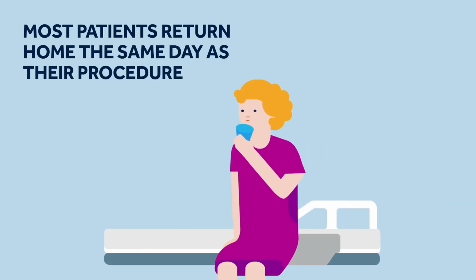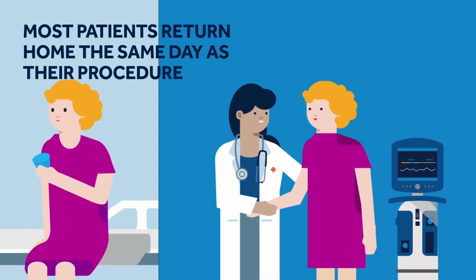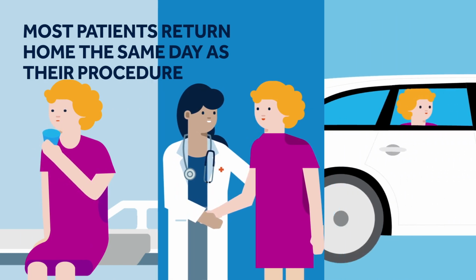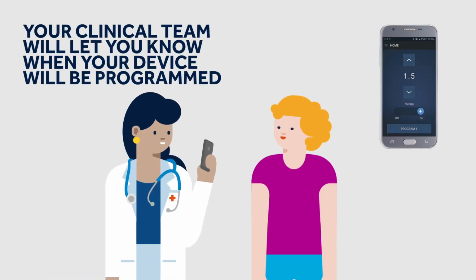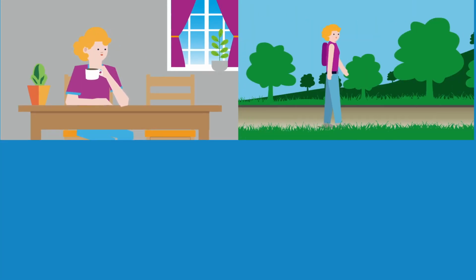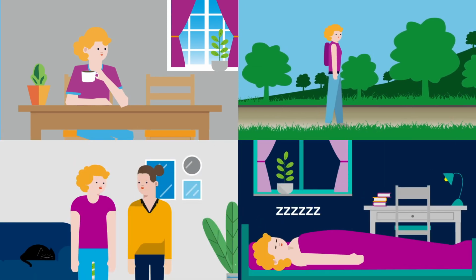After the procedure, you may feel a bit sore, but this is quite normal, and you will begin to feel more comfortable in the days that follow. Either on the day of your procedure or a few days afterwards, someone from your clinical team will program your device to reproduce something like what you experienced during the evaluation phase. After your device has been programmed, it will normally run continuously for 24 hours a day.